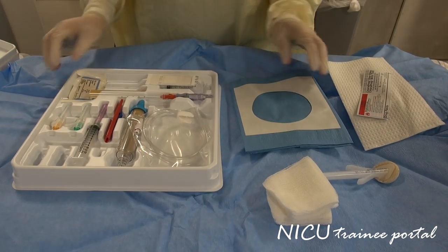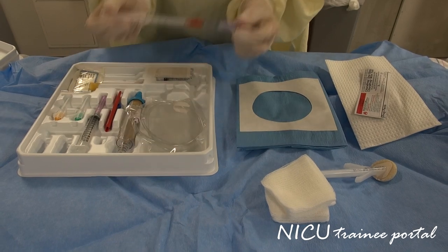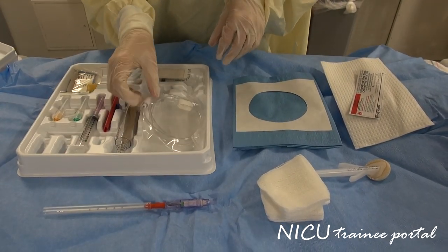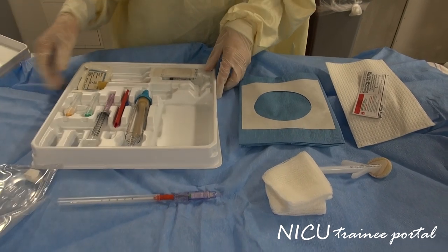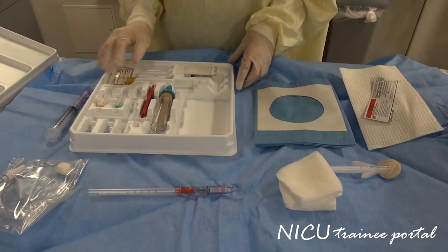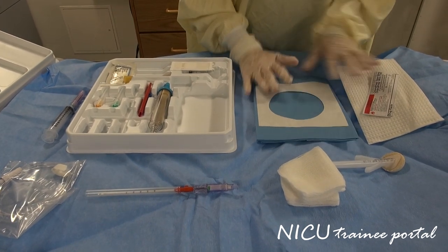First we set up the kit. This is the chest tube, our connector, additional syringes, and sterile equipment.